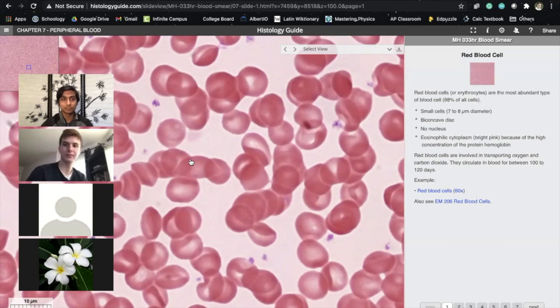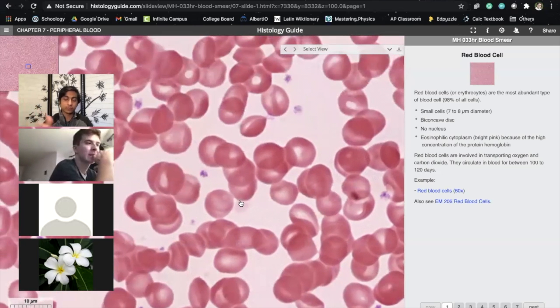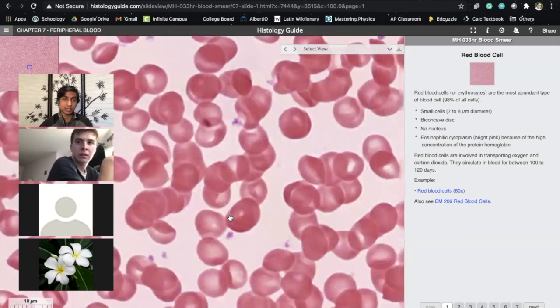Remember? Do they not have nuclei? That's right. That's exactly right. And so when you know there's a red blood cell there, if you're looking at the histology, there is no nucleus, which is one of the major things that allows us to deviate from most of the other cells that we have in our body. And that really is one of the reasons that it allows for the hemoglobin, and forget about it. I'm not going to explain it, but basically it's the way that it transfers oxygen, moves oxygen throughout the body and carbon dioxide and moves it around.